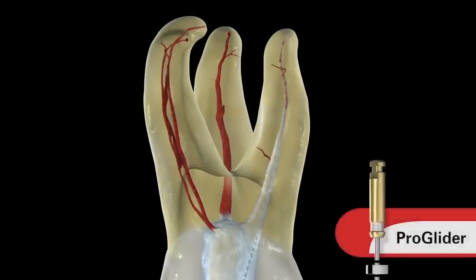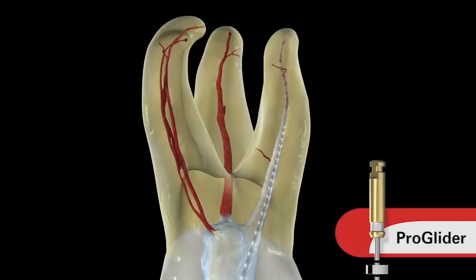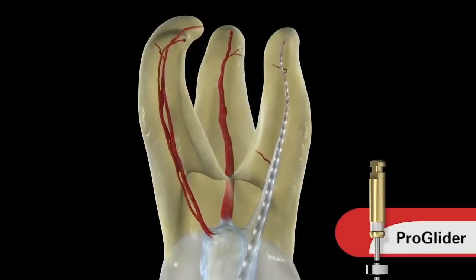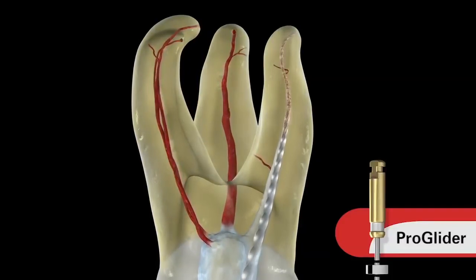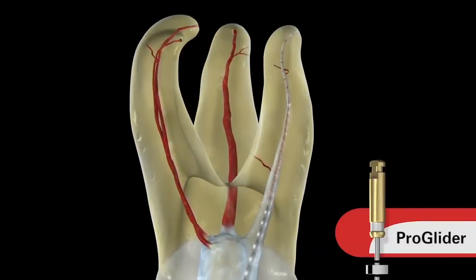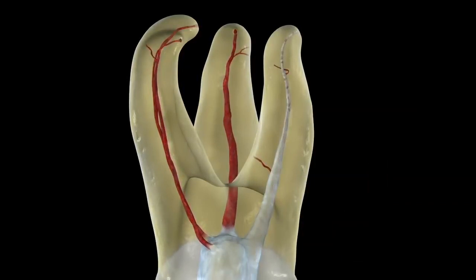Irrigate, kick out the viscous chelator, top off with sodium hypochlorite, and let ProGlider run — let it advance and progress towards length. If it bogs down a little bit, lift the file up; this will allow debris to auger back up the blades, free up the file so it can engage, cut, and move towards length. In one or more passes, you can generally carry your ProGlider to the full working length. At this point, we have a smooth and reproducible glide path ready for mechanical shaping procedures — probably the best glide path we could ever cut, because not only is it smooth and reproducible, it's considerably bigger than a 15 file or any other company's multi-file dedicated glide path sequence.